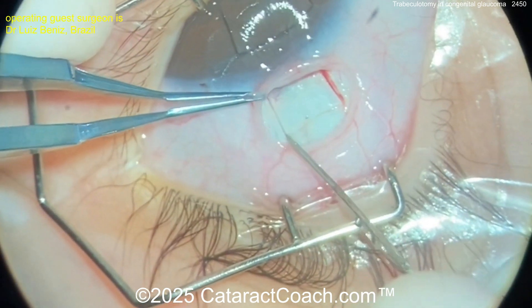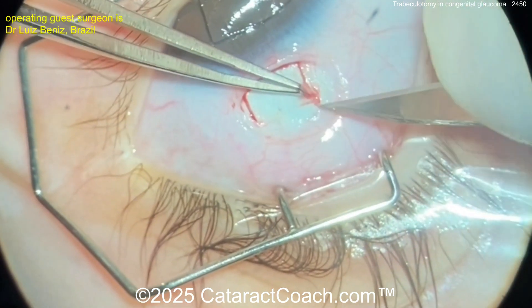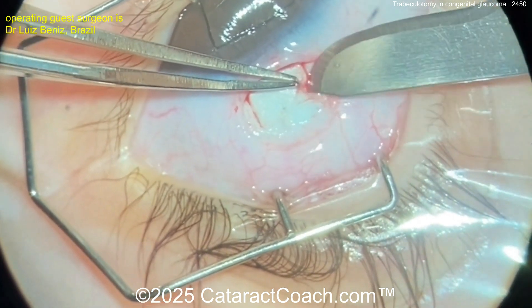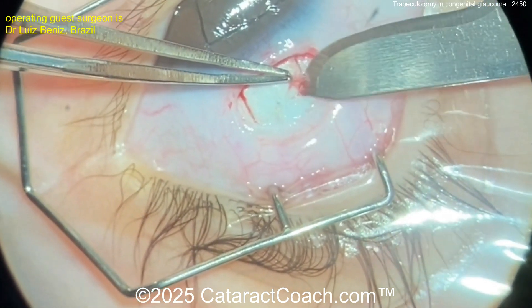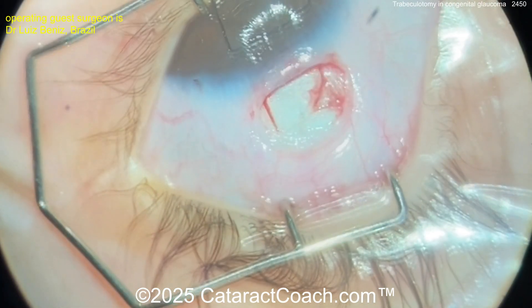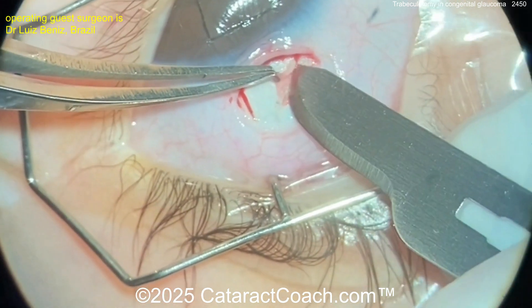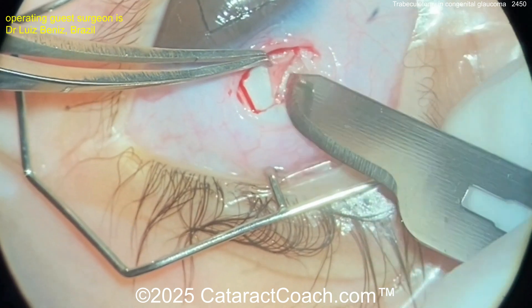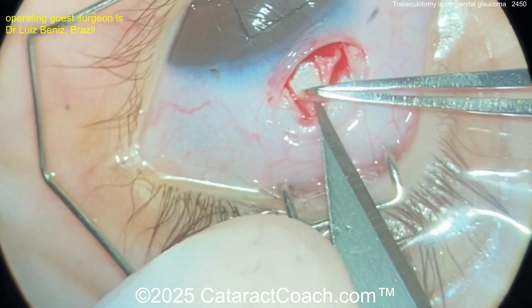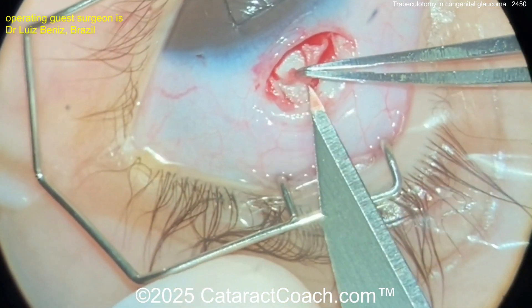Creating a scleral flap at about half scleral depth. The traction suture is really very helpful in this case. Obviously the patient is under general anesthesia. Now using this curved blade to create that half scleral depth groove — there we go — and cutting across, creating the whole flap. I tend to do the whole thing with a crescent blade, but whatever you've got, you're going to use. Very carefully done — I like the care taken in the dissection to make it very precise.